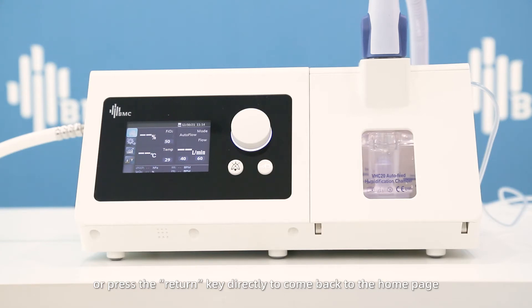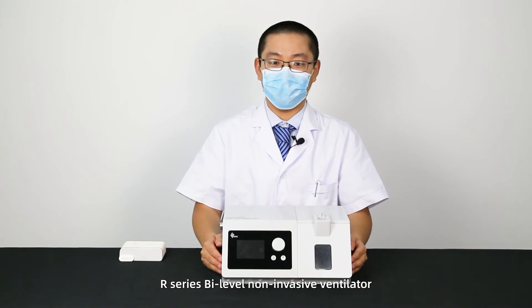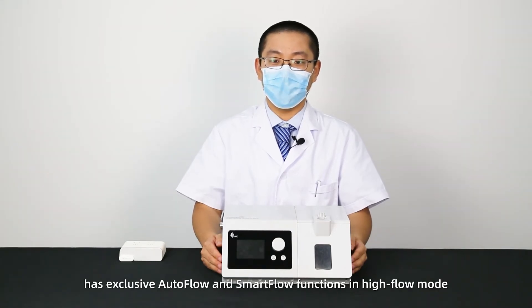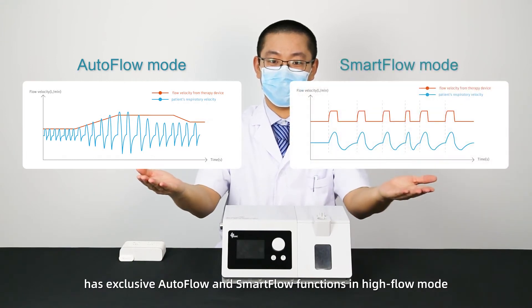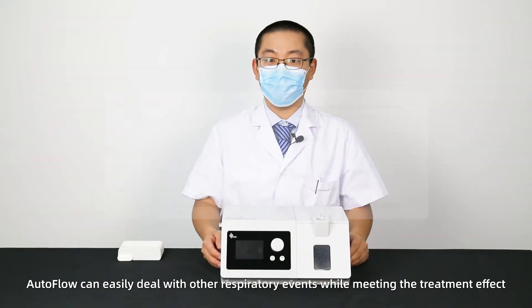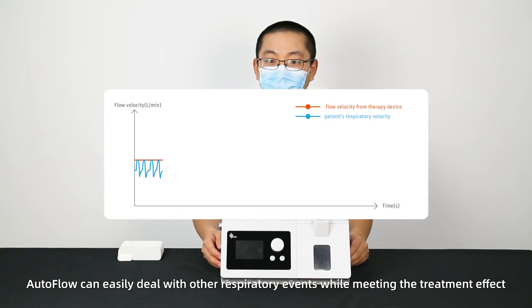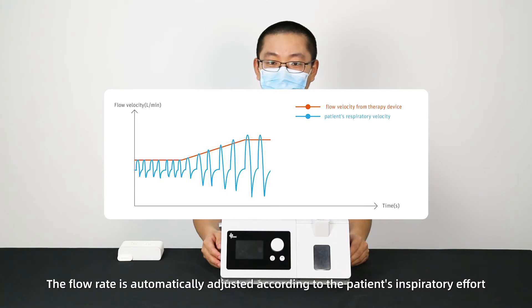R-series bi-level non-invasive ventilator has exclusive auto flow and smart flow functions. In high flow mode, auto flow can easily deal with respiratory events while meeting the treatment effect. The flow rate is automatically adjusted according to the patient's inspiratory effort.